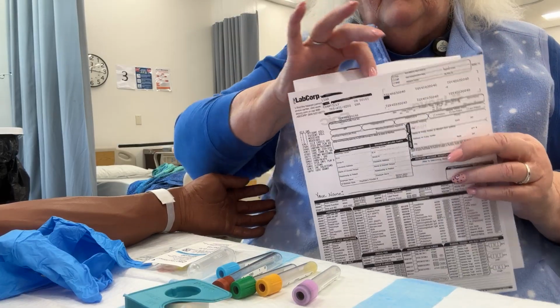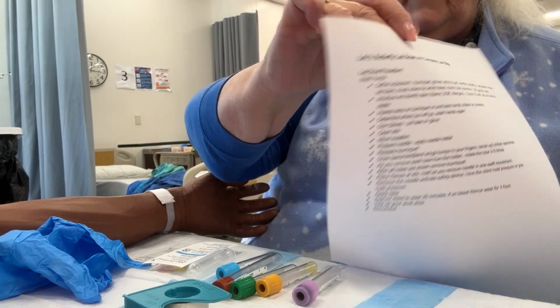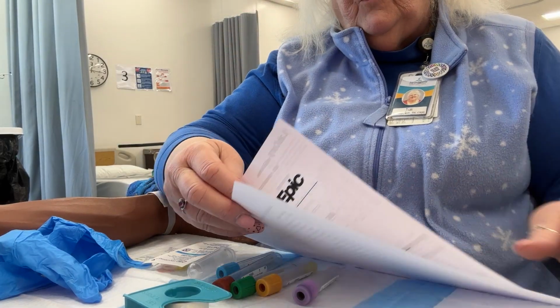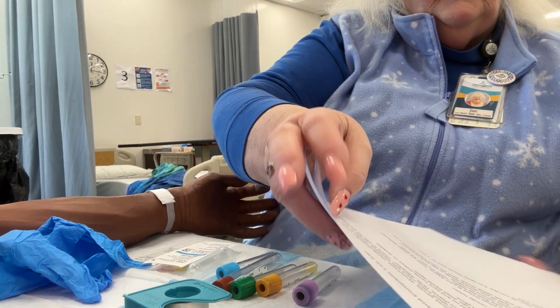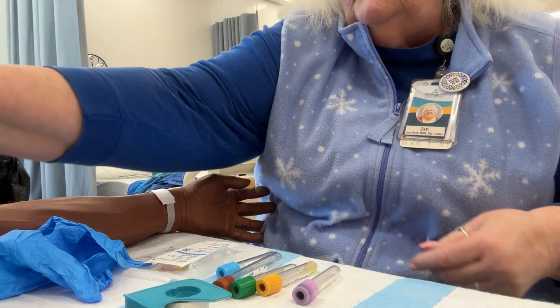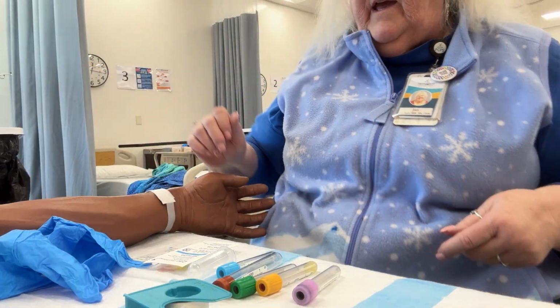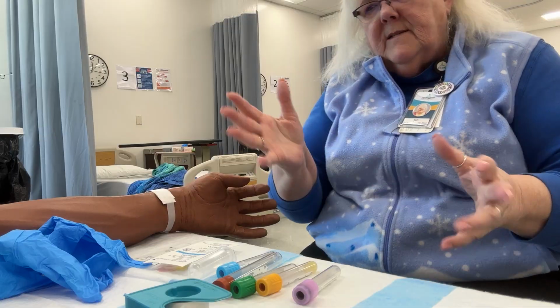Then you have your new sheet of directions for this particular lab. This time we are drawing a butterfly, and so that's what I'm going to show you here in the video so that you will have it to be able to use. Okay, so step 1 is always wash my hands, gather my supplies.